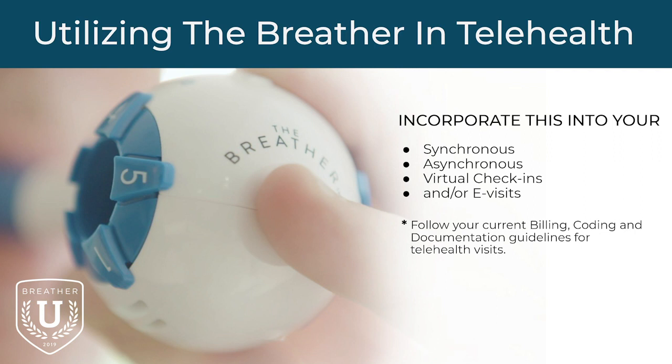Some items that you may want to have handy would be pen and paper or tablet, however you're documenting. You want to have a timer, or you could use your phone as a stopwatch. You want to have a breather for you and a breather for your client so that you can demonstrate and show them how to utilize that. You want to have any handouts available. So maybe you have an exercise sheet.